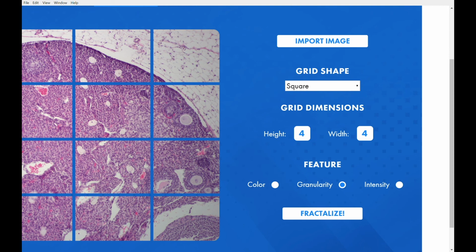Because the preprocessing reduces the amount of colors in an image, we are able to better see clusters of stained cells. Once generated, the values from each image voxel return to the user and are then displayed on the GUI as we see here. Proper histopathological analysis is critical for medical professionals to determine the presence of diseased tissues.